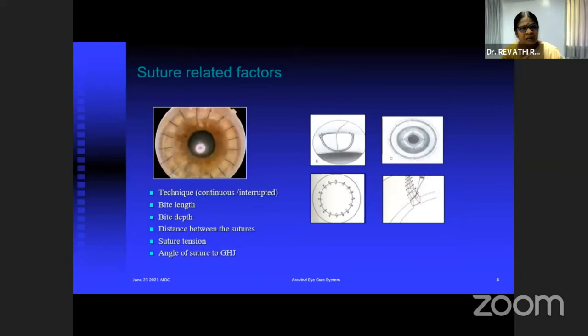And coming to the suture, this is the most important thing because this is going to decide the visual outcome. And here we have to go to almost 80 to 90% depth. So on the graft side, the cut donor side, you can see a sharp glistening edge. That is the Descemet's membrane, and just above that, the suture should come out.